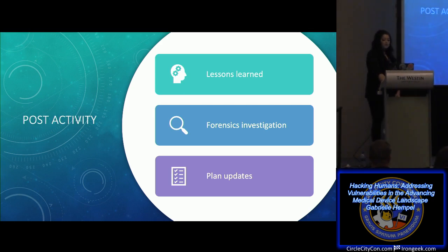Finally, phase 4 is the post-activity phase. Here we assess the lessons learned and conduct hot wash sessions to elicit feedback on future responses. We'll also engage a forensics investigation at this point if needed and make any plan updates we feel necessary for the future.